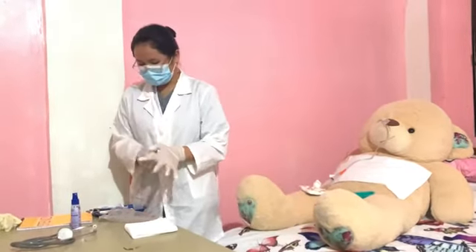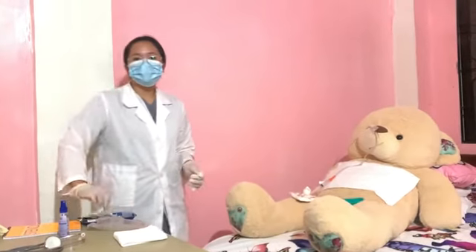And then, after that, measure the length of the exposed tube, reinforcing the marking on the tube at the nostrils with indelible ink.